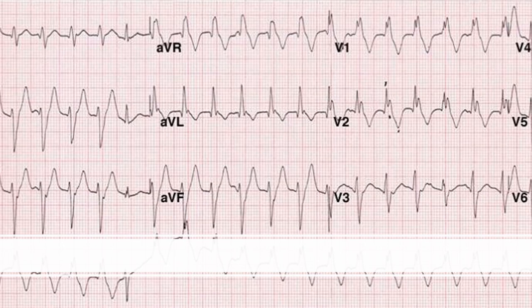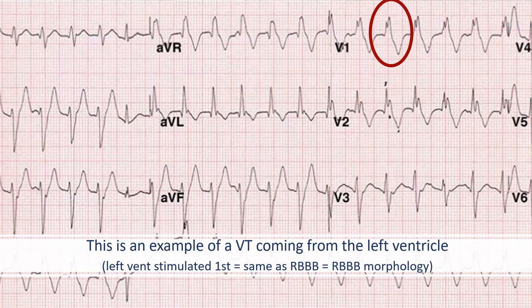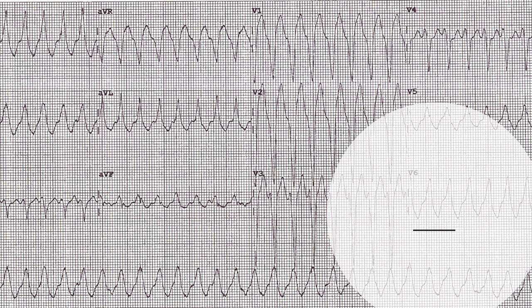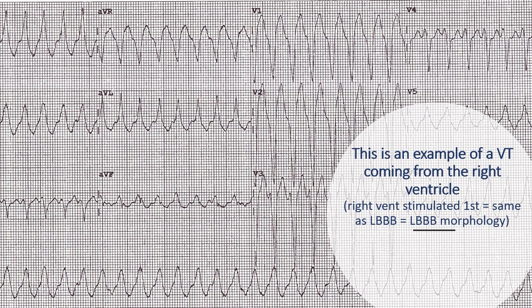Looking at this ECG showing broad complex regular tachycardia — VT — if V1 shows right bundle branch block morphology, we know the VT focus is in the left ventricle. But looking at our ARVC case ECG, it shows left bundle branch block morphology in V1, so we automatically know the focus is in the right ventricle. VTs associated with ARVC are almost always left bundle branch block morphology — and now we understand why. So: a ventricular tachycardia with left bundle branch block morphology should make you think ARVC.